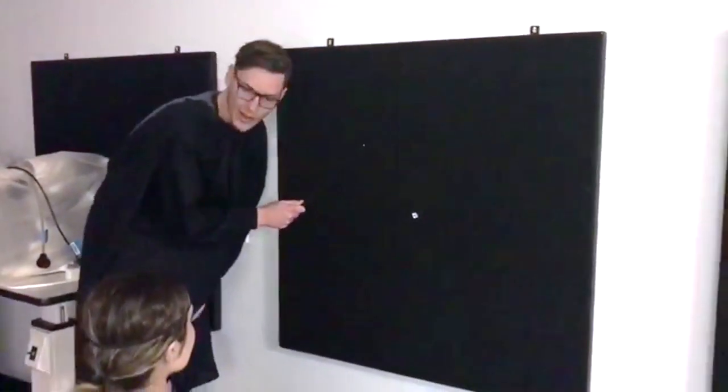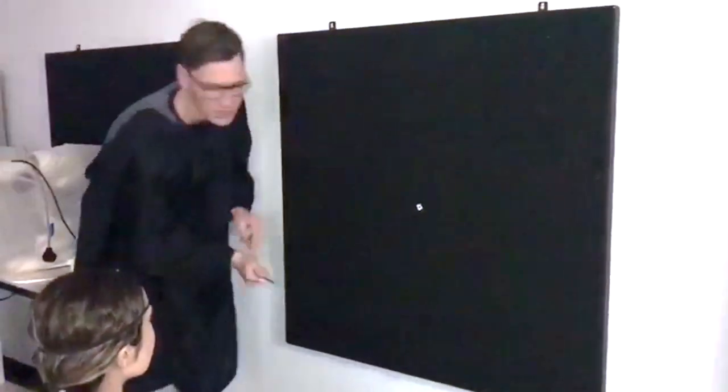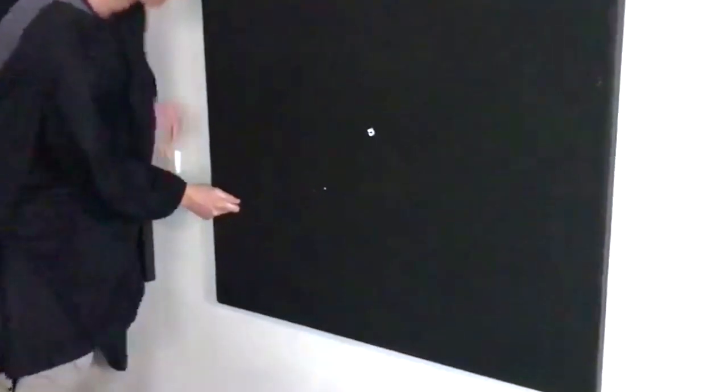The examiner asks if the patient can see the white dot here. The patient responds no, they cannot see anything. The examiner asks again at another location, and the patient again responds no.